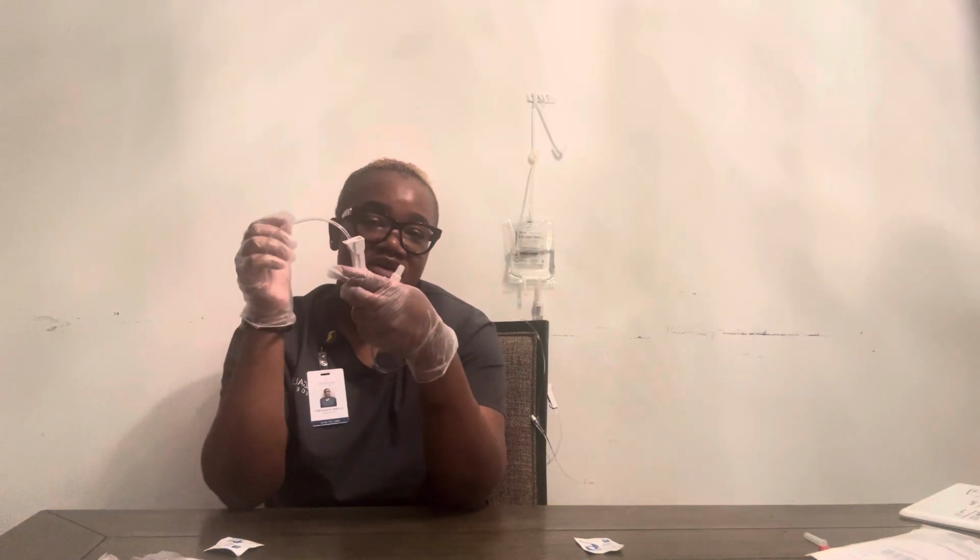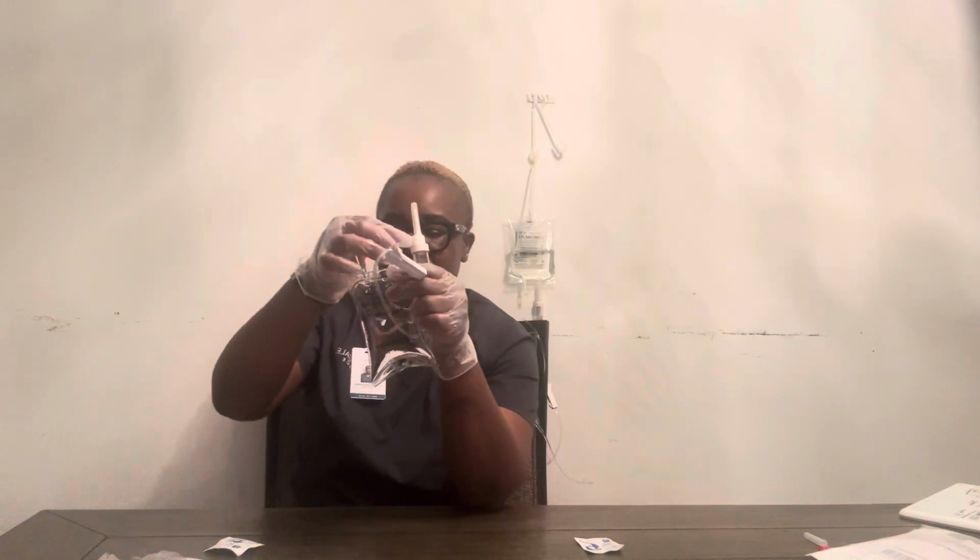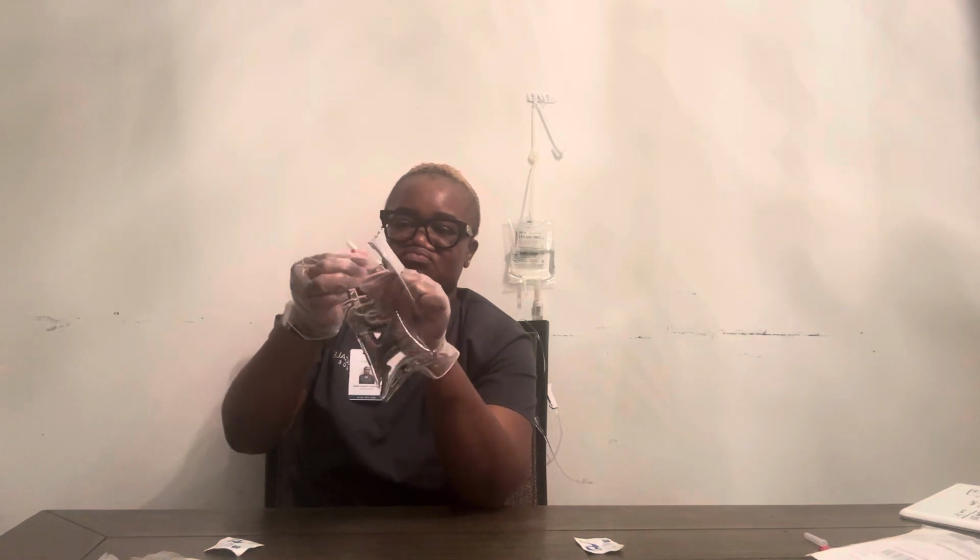So I'm gonna remove this, and the parts are the same. I have my spike end, my drip chamber, my roller clamp, and the adapter end. The only thing is that this doesn't have a Y port. So I'm gonna open this and spike my bag.